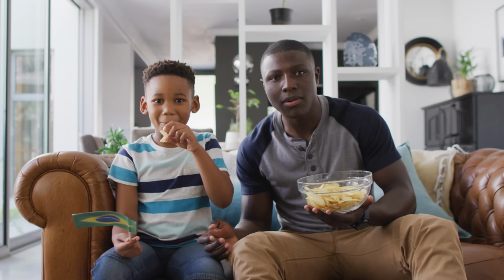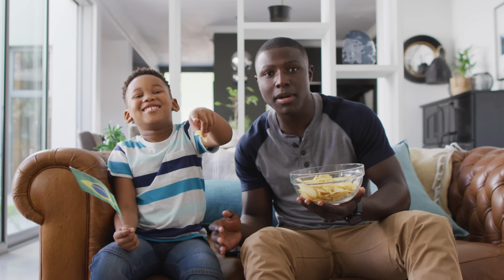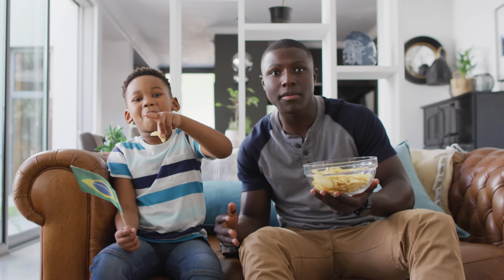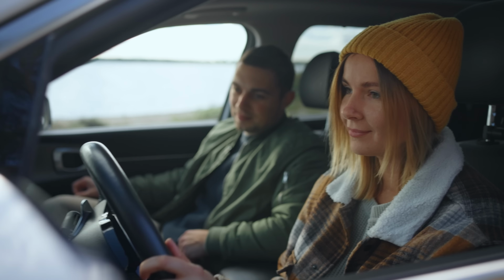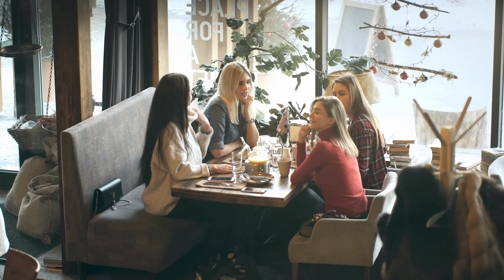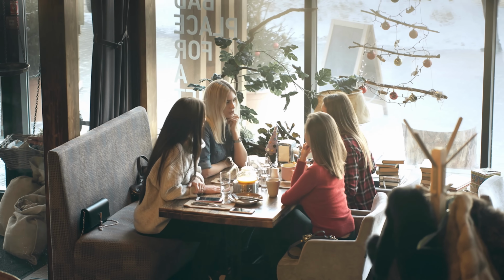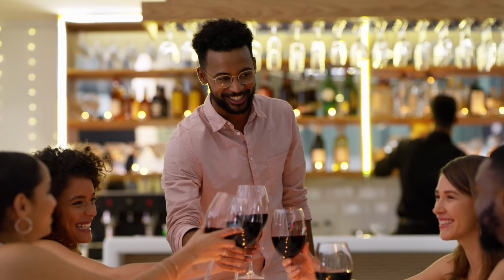For example, if you're sitting at home watching TV and it's relatively quiet, your hearing aids will put you into a calm situation program. Then if you decide to hop into the car to drive to a restaurant, the hearing aids will put you into a speech in car program to handle the road noise. Then when you get to the restaurant, the hearing aid will either switch you into a speech in noise program, or if it's incredibly noisy, switch you automatically into the Speech in Loud Noise program.